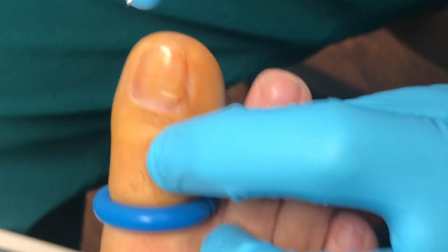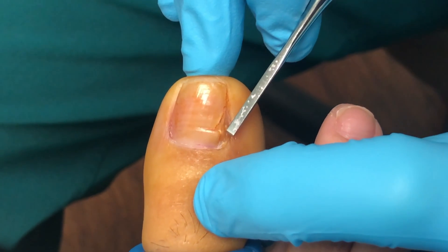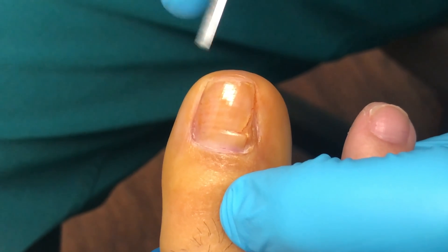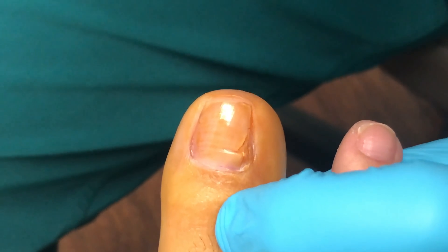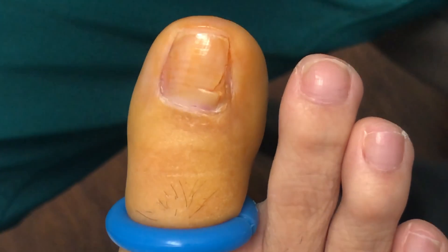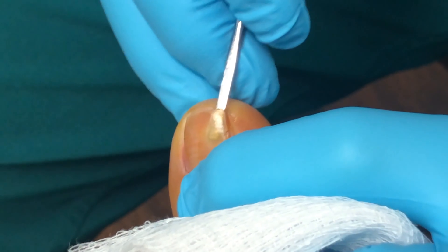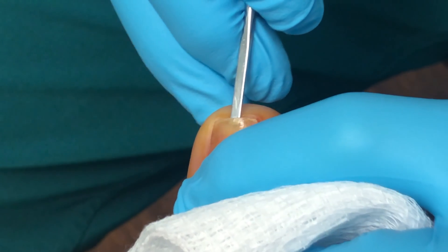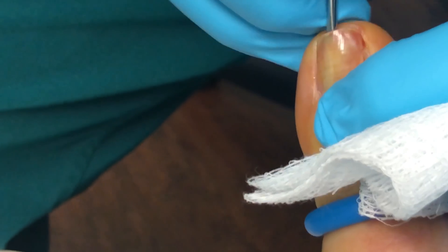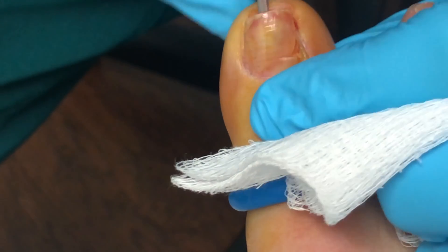So she's already numb. You can kind of see the bump right here — this is where all of her pain is. Unfortunately, because of where it is, we've got to take the whole nail off first and then we can get to it a little bit better. So let's do that. Let's take the nail off and then we'll get that little mass out of there. Let me know if you have any issues, okay? You're not looking? You're missing all the good stuff.